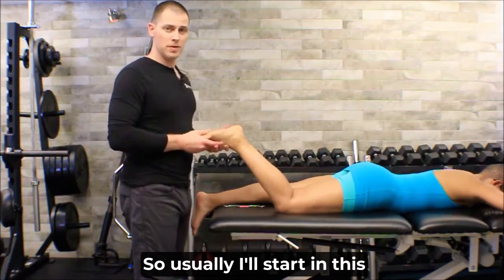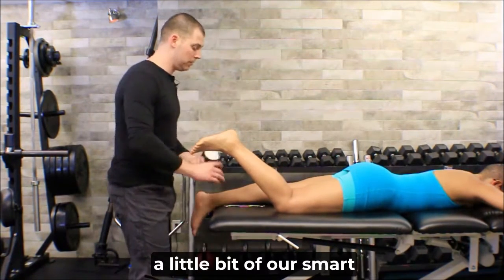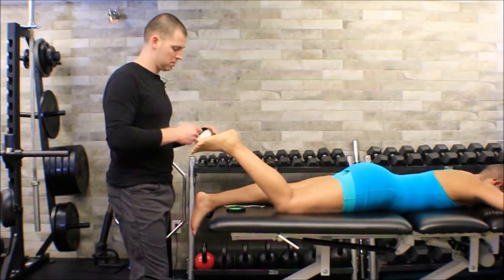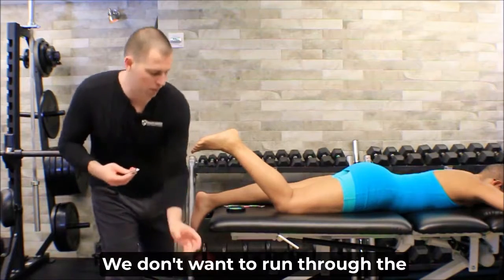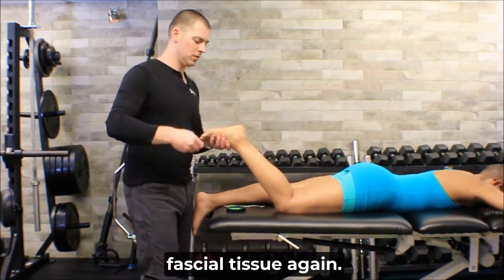So usually I'll start in this position to do these techniques. We're going to go ahead and use a little bit of our Smart Tools cream here. Right? We don't want to run through the skin before we affect the fascial tissue.